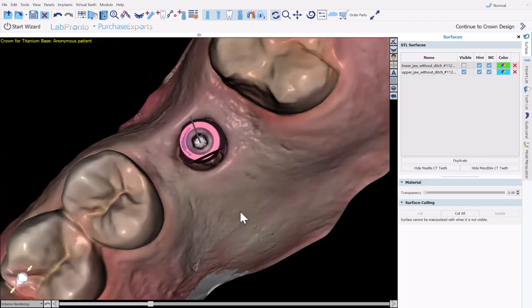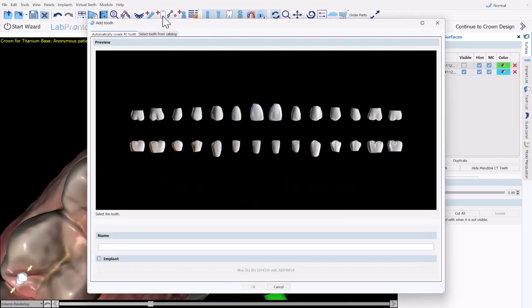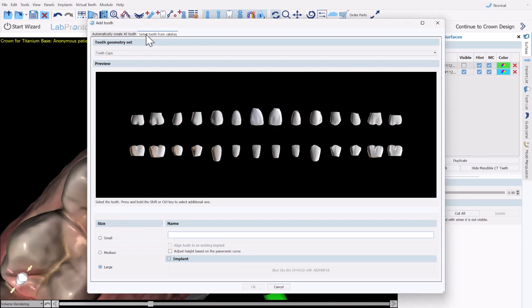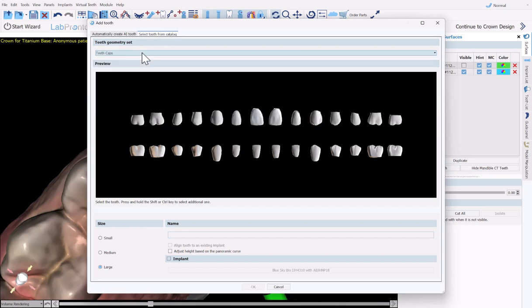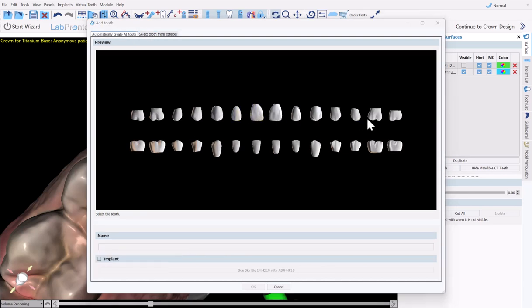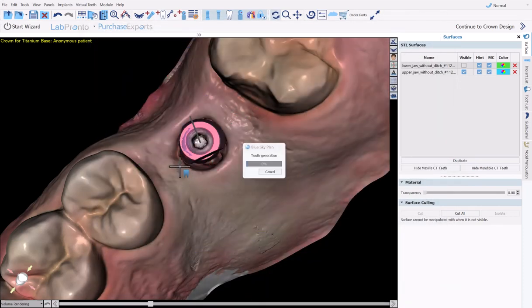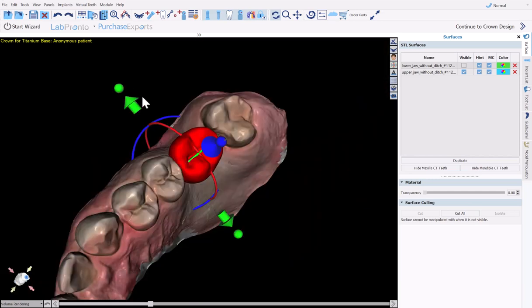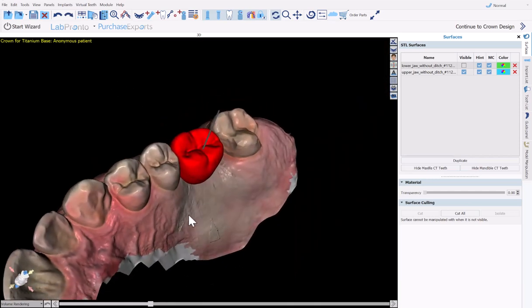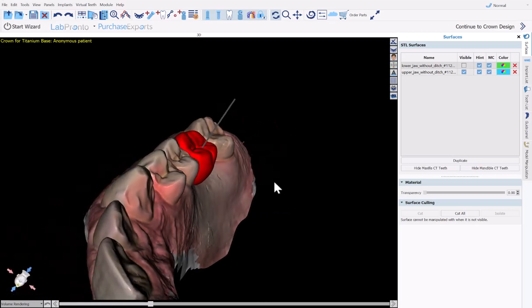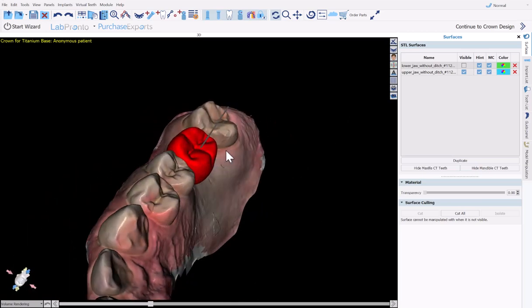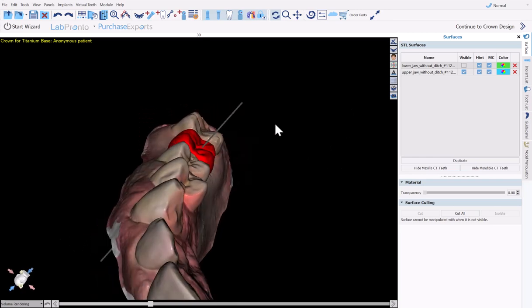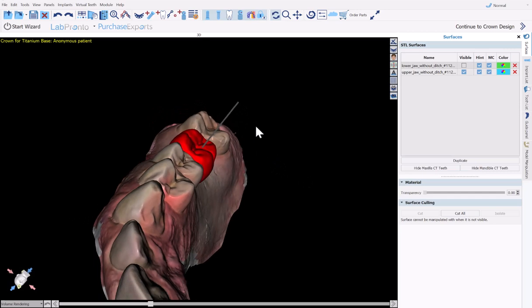At this point, we're going to add the AI design tooth simply by clicking the Add Tooth button. Here we have two options: Automatically create AI tooth or select tooth from catalog. The option to select tooth from catalog is the option that we've always had where you could select a relevant tooth library and add the tooth from the tooth library. The new functionality is to automatically create an AI tooth based on the particular data set for your particular case. We're going to indicate the missing tooth and then click the OK button. We are now going to single-click in the area of the missing tooth. And we could see that the software has generated and placed a tooth for the case. Now that we've aligned the scan body and the tie-base abutment, and we've generated the tooth design, we're going to click on continue to crown design.